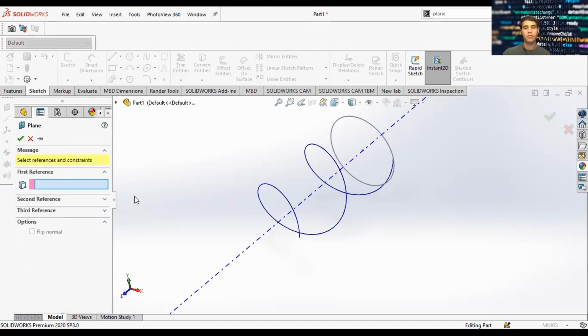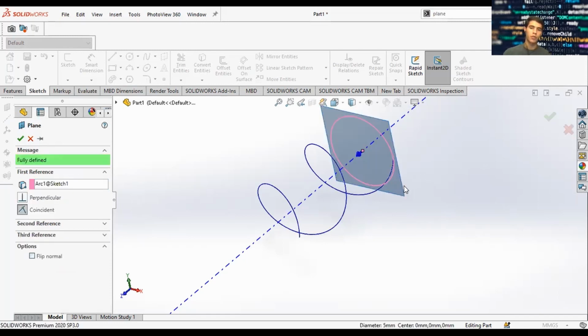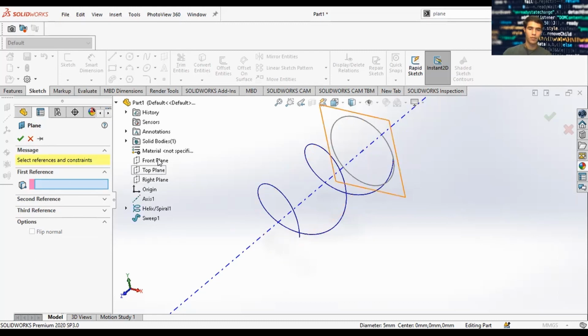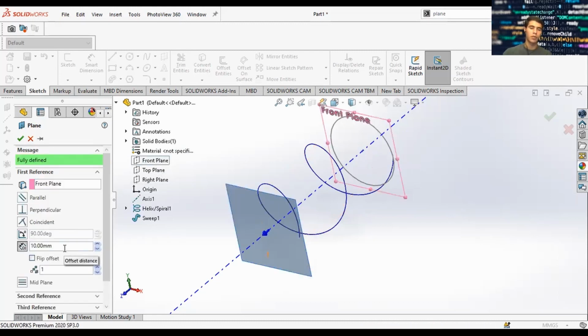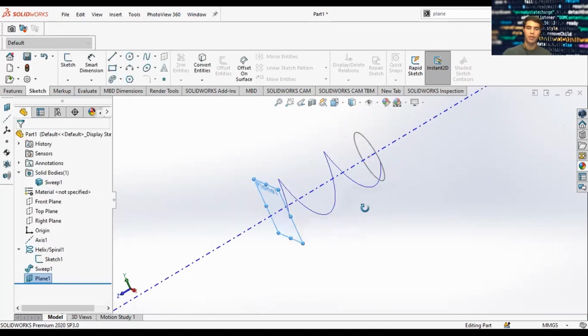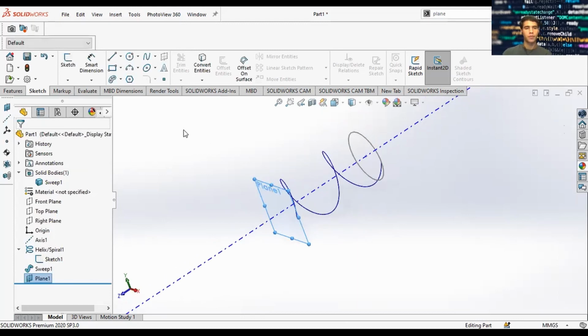Now I want us to select reference geometry because SolidWorks is parametric modeling, so I need to have a parameter by which to model all the parts. This is going to be our first parameter, this sketch we did. There you go. We're going to select our main planes. We're going to make it 10 millimeters away from the main plane. So this is the front plane. We're going to make a different plane, just 10 millimeters away from it. So we're putting a distance parameter.